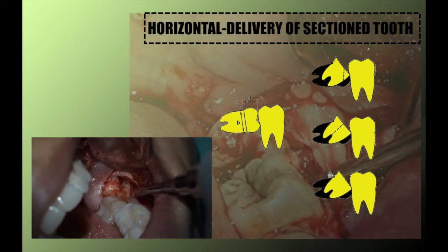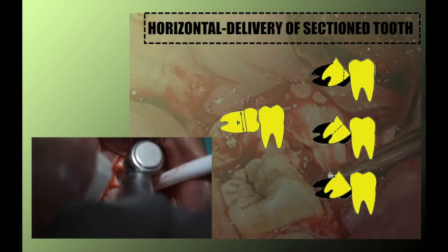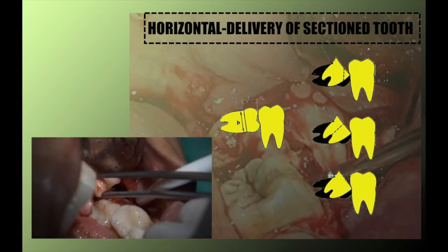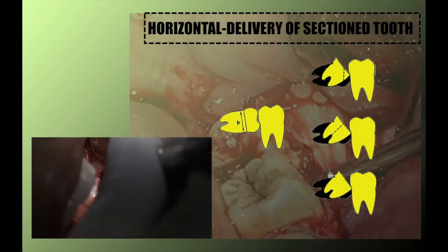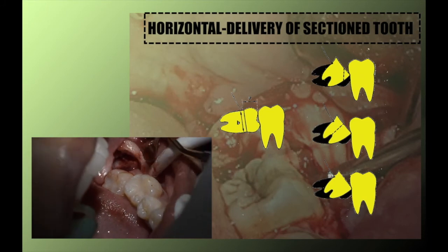Options when this happens are shown here in the diagram. A technique wherein I split the root is also shown in this clinical video. Personal insight, I'd consider sectioning the tooth first before extending my bone reduction. That's my tooth versus bone concept.